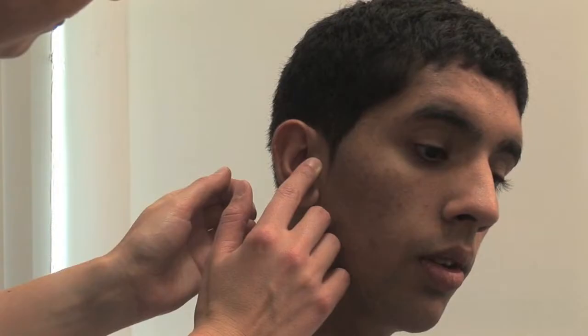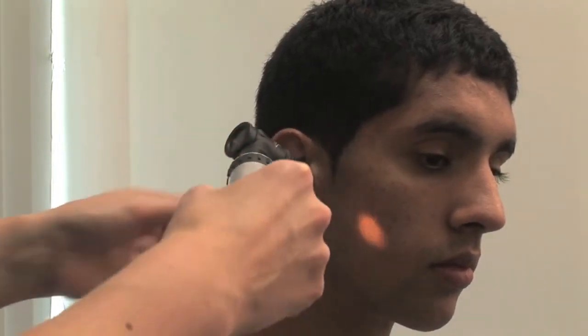How about this? No. Inspect the meatus. Is there evidence of previous surgery? Select the largest speculum that can be inserted comfortably and explain what you're going to do.